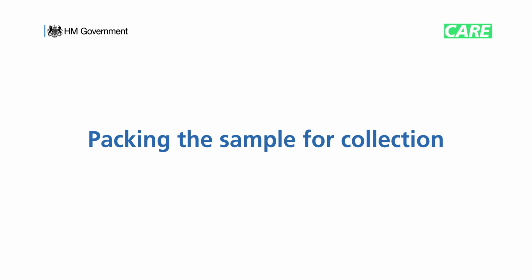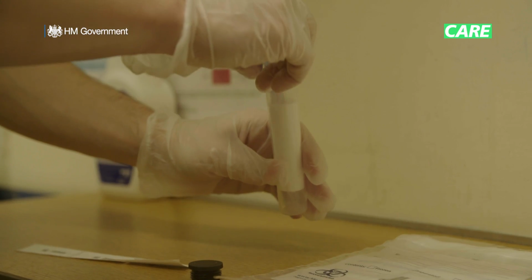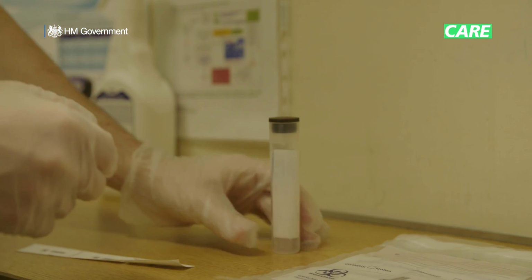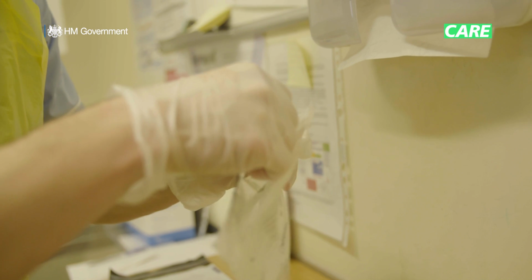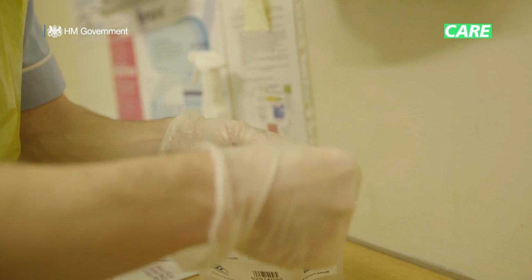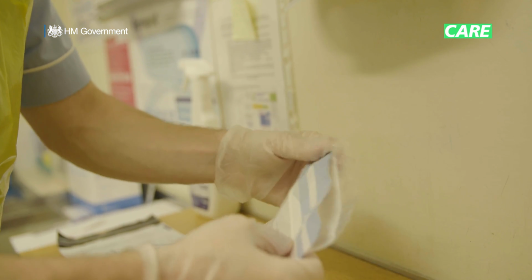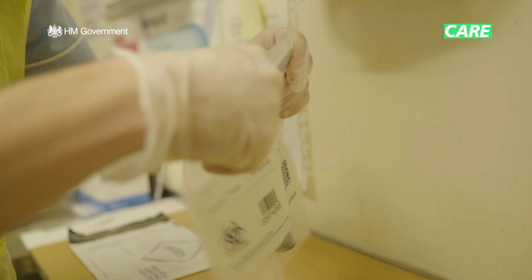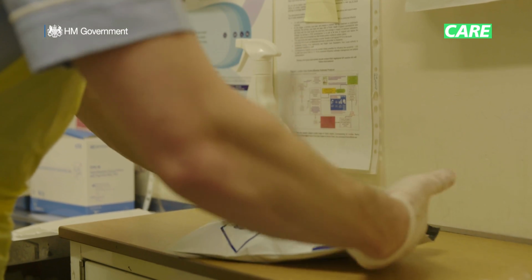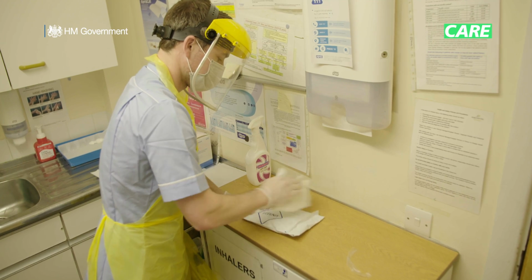Take the labelled plastic vial that contains the swab and place it into the transportation tube. Place the provided lid onto the tube securely. Next, place the transportation tube into the labelled patho-seal bag. Secure the bag shut by ensuring the adhesive strips make a tight seal. Place the sealed patho-seal bag into the large envelope from your kit. Seal it shut and wipe down the exterior of the bag.